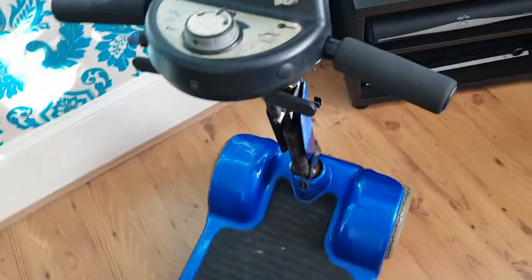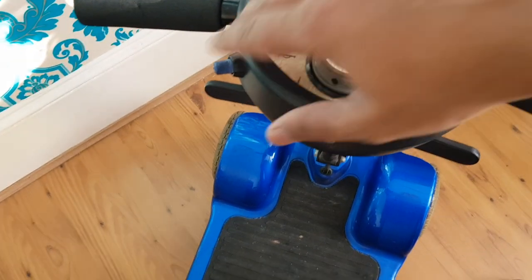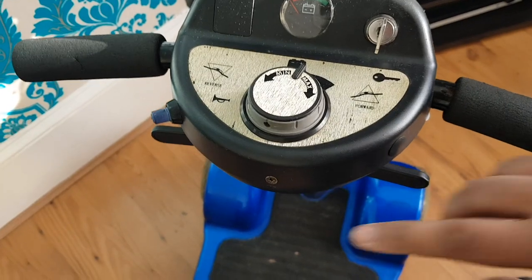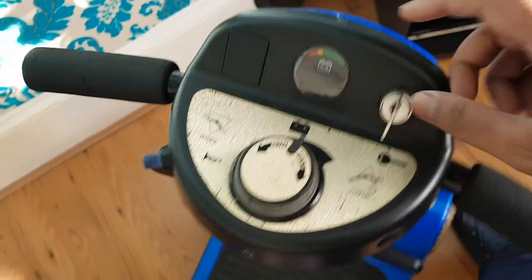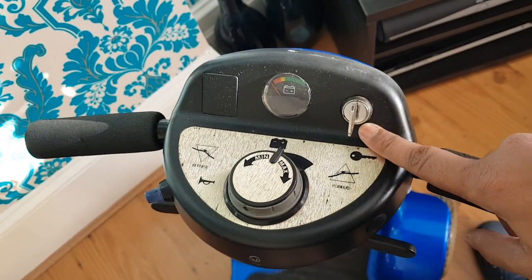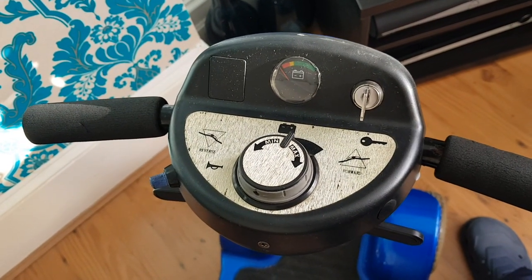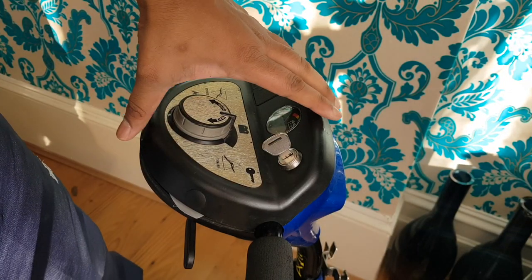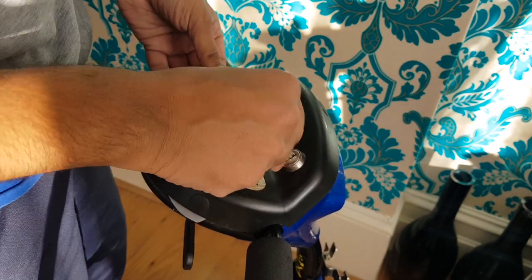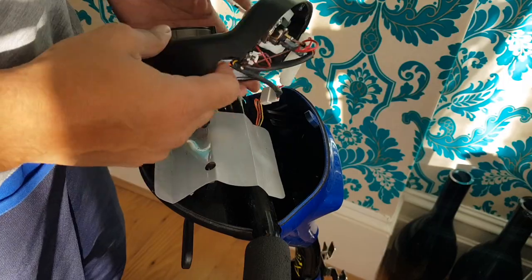So I turned my attention to this bad boy — the control panel. Maybe it's a faulty dial, maybe it's something else. We're going to open this up — screw there, screw there — take a look at it and see where we're at. I've got the screws off and we're going to flip this over. Still no power when I turn the key, so let's have a look underneath.